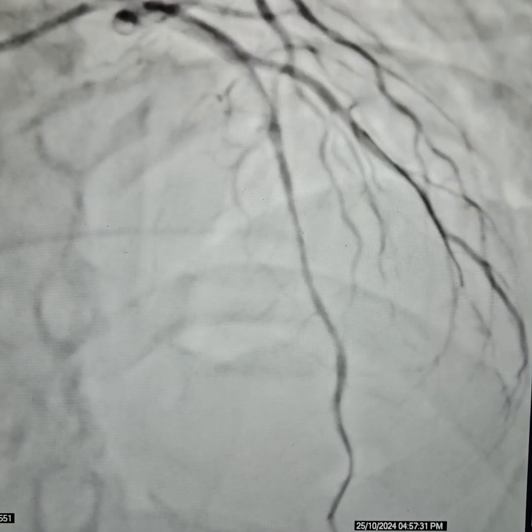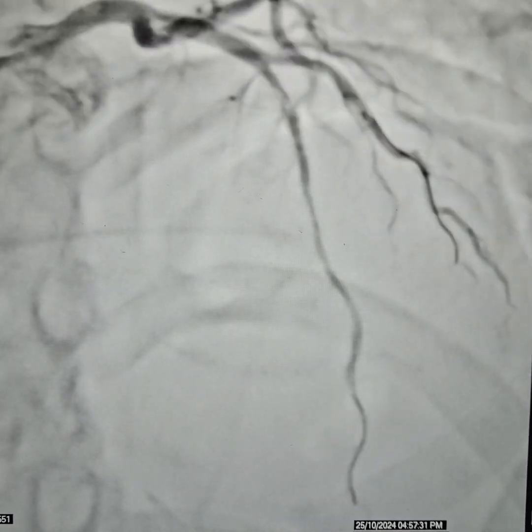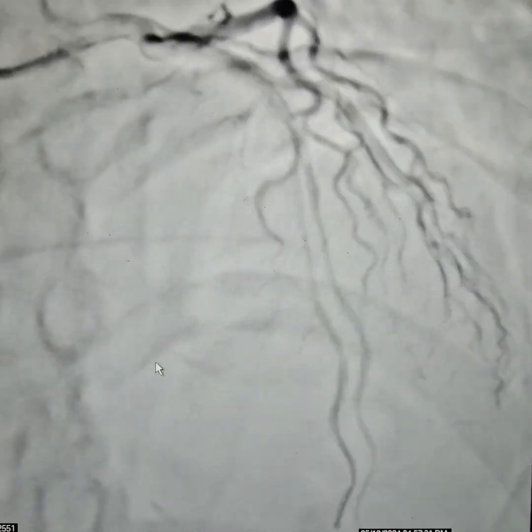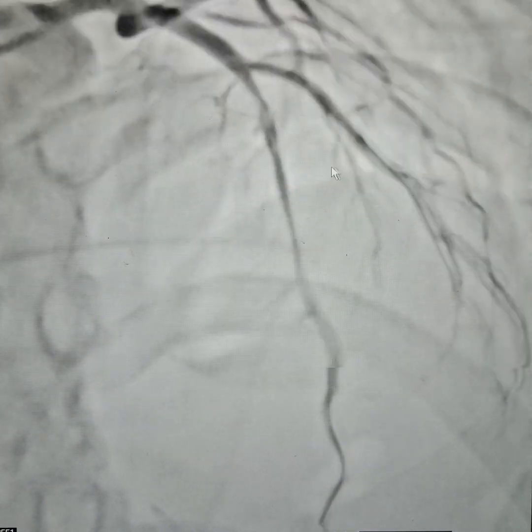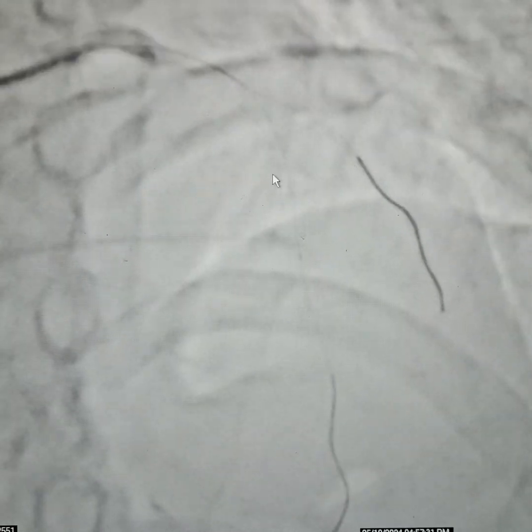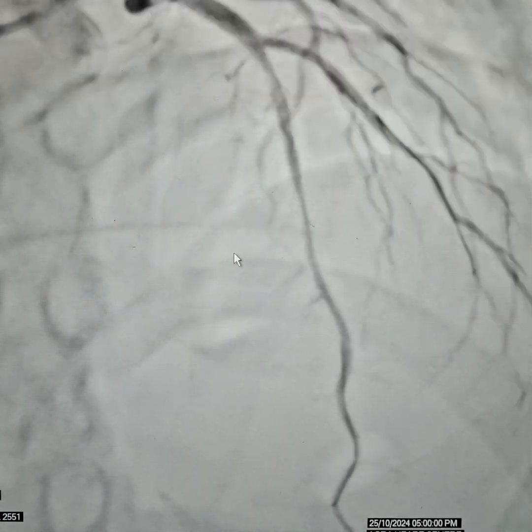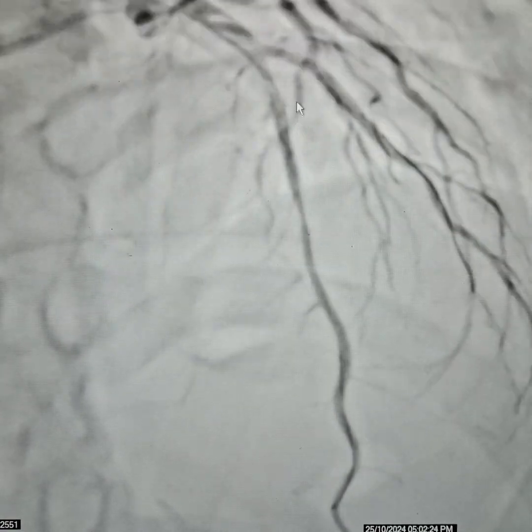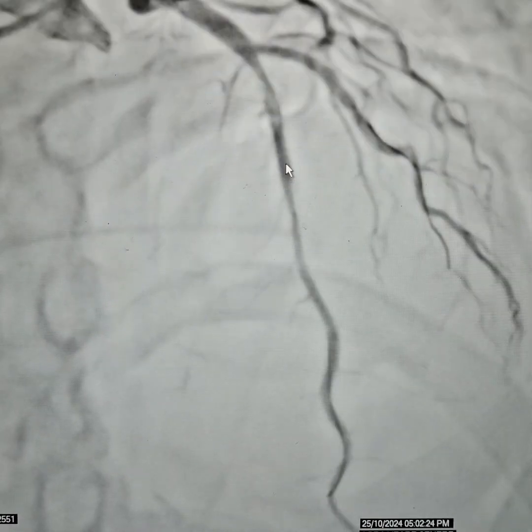We placed the first wire in the diagonal and the workhorse wire in the LAD. We had a lot of discussion whether to stent this portion or not — we were not very keen on stenting it. We gave some nitrates, but this did not improve a lot. We can also see some dissection happening here, which is very common.